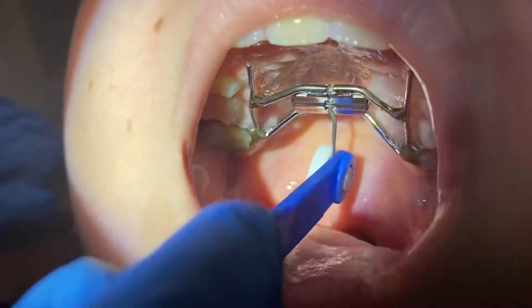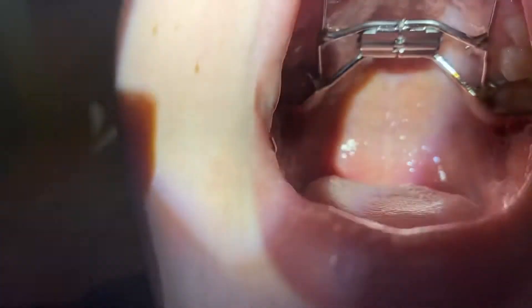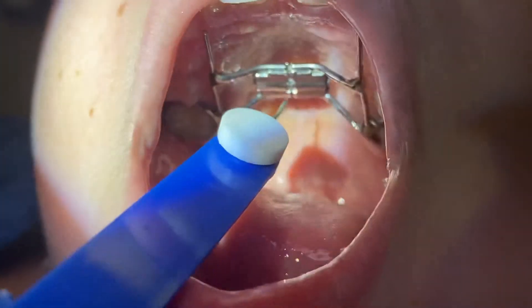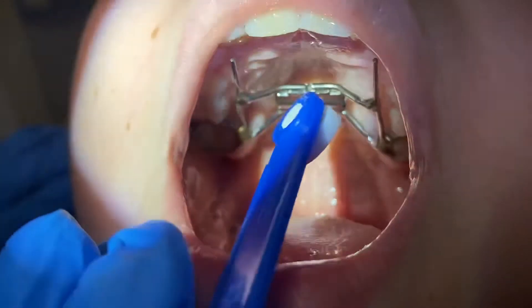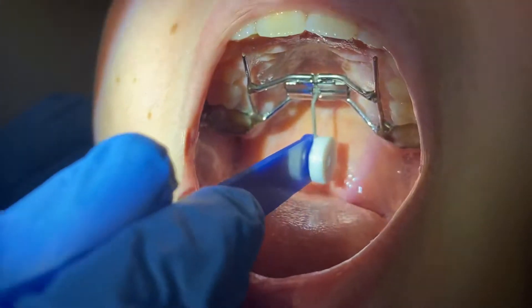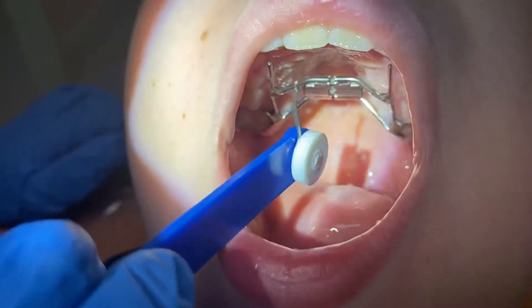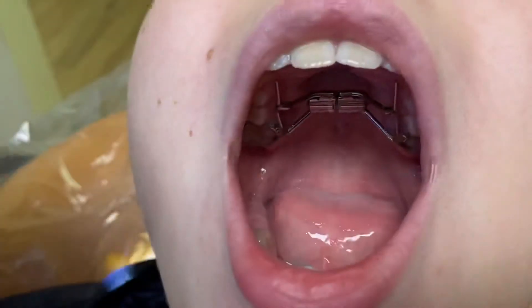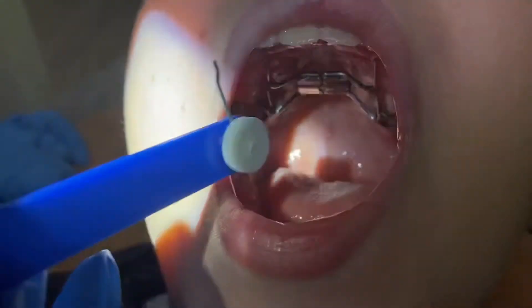I'm stuck here so I cannot move anymore — I take it out. That's two turns. Every time I do a turn, a new hole opens up in the front. This is my third turn; I take it out — so that's three turns total. We need to do one turn in the morning and one turn in the evening.